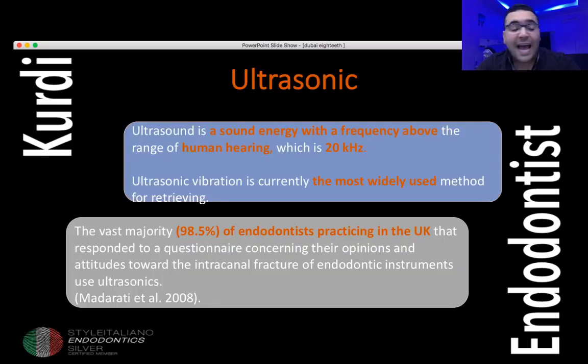Alright, now ultrasonic. We have to mention ultrasonic today in our lecture because if we are going to talk about retrieval of broken files, we have to mention ultrasonic. Simply because, according to a study by Dr. Madirati et al., they concluded that about 98.5% of endodontists in the United Kingdom use ultrasonic in their retrieval. So, ultrasonic is a must if you are going to retrieve files. You will need it.